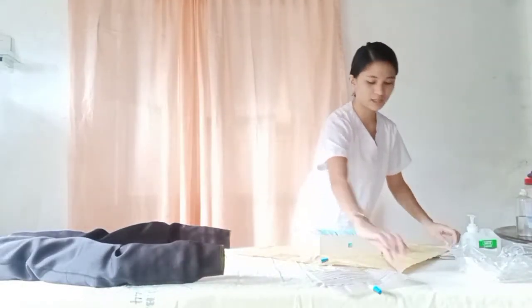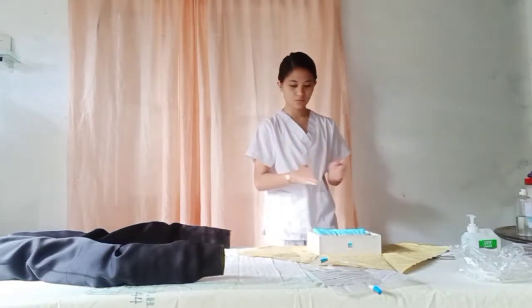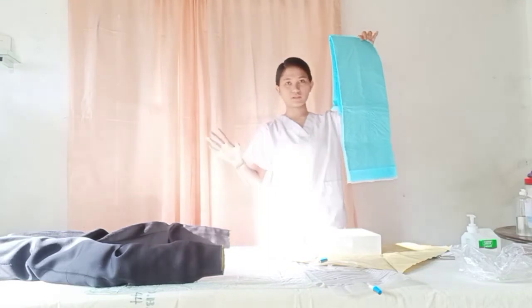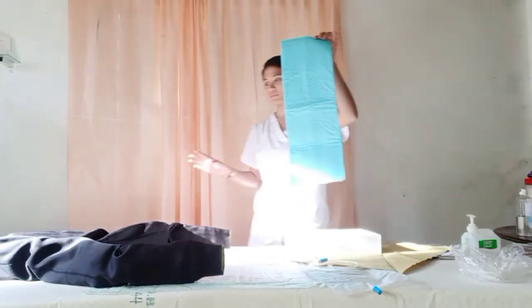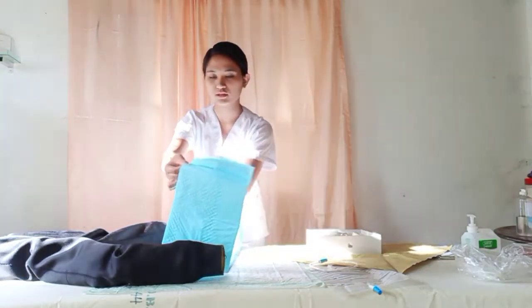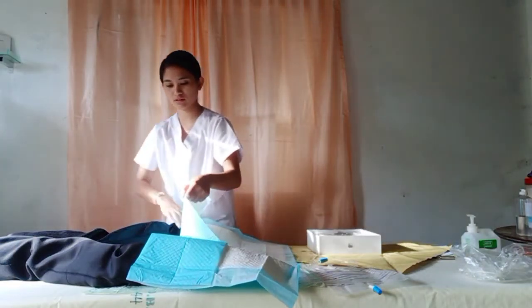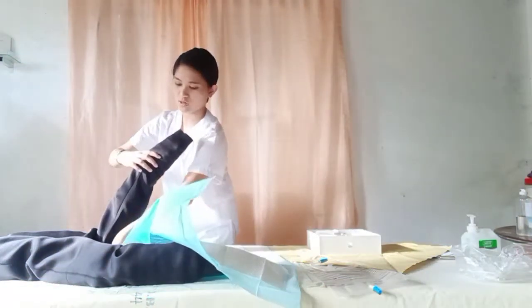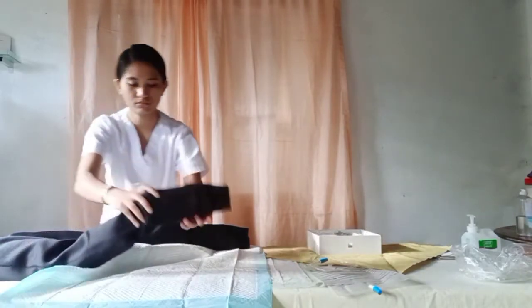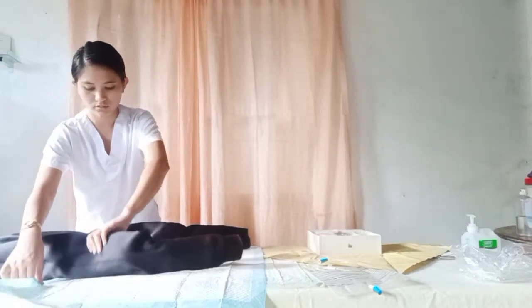Leave 1 inch on every side of the cover. Now get the drape and place it under the buttocks of the patient. Make sure to maintain the sterility of the drape. Mrs. Cruz, I need you to lift your buttocks gently while I am placing this underneath your buttocks. Make sure not to touch the center of the drape.